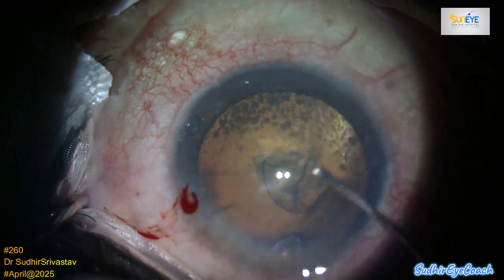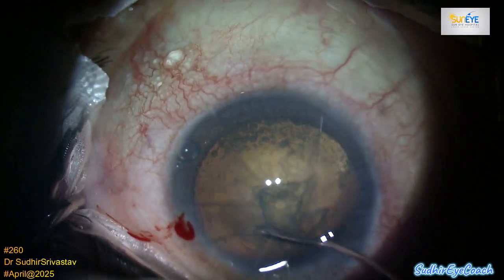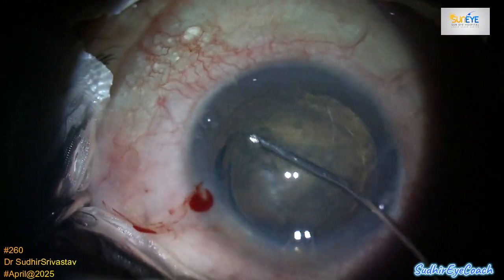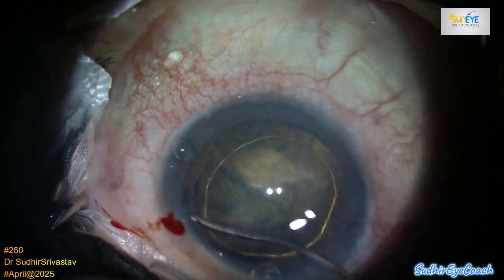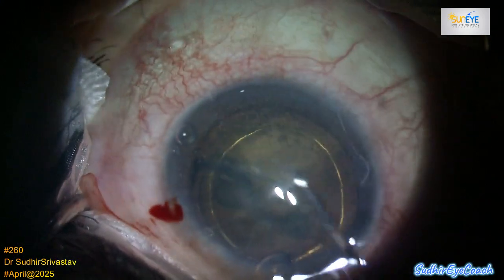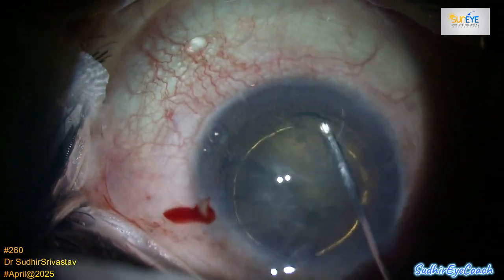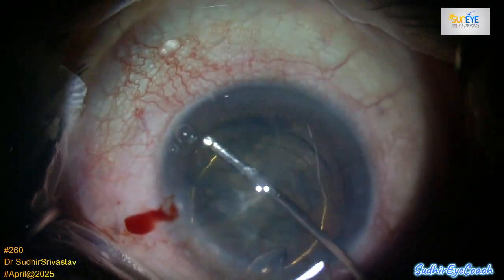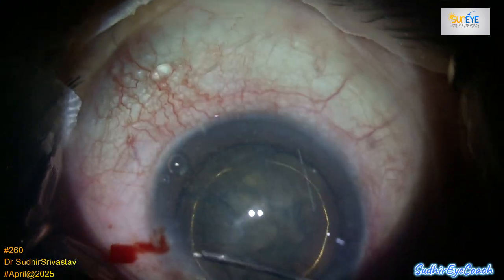After lens implantation, I always advise a retinal evaluation to ensure the retina is stable and to plan further management if it is required.